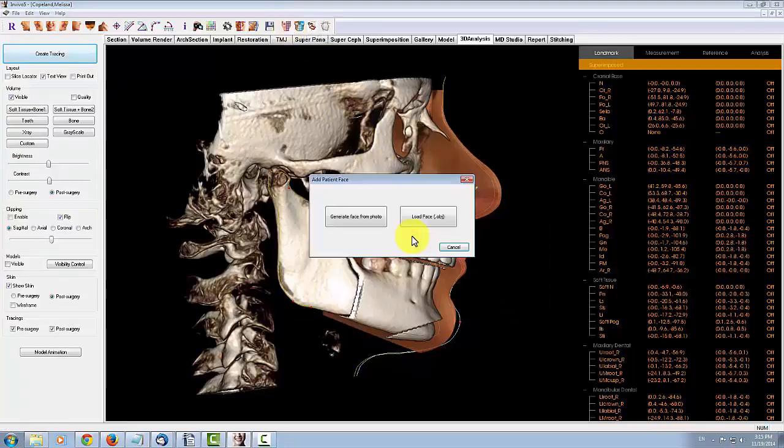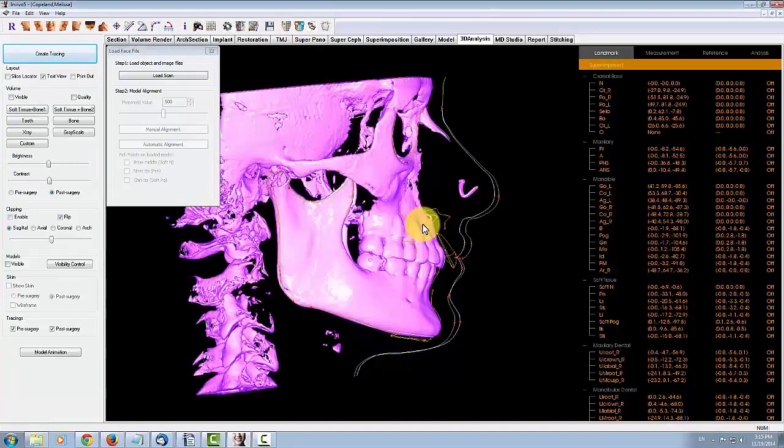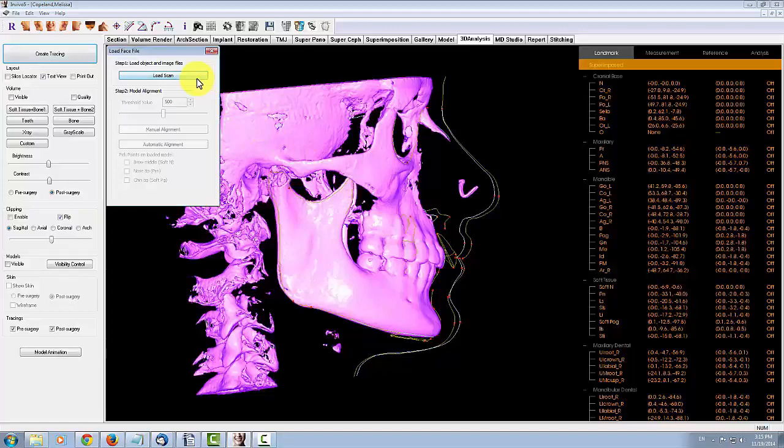You can load the photo by using the Create Face Photo tool and selecting Load Face. Once you load the 3D camera data, you can register it to the scan.